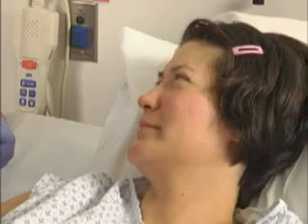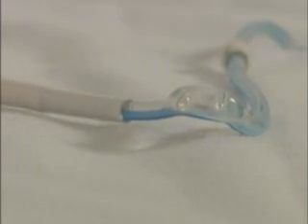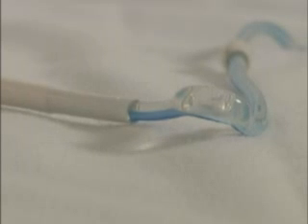This patient told me sometimes if I flush real firm, it can work. Do you want me to give that a try? No, you shouldn't do that. Using excessive force can cause this catheter to aneurysm or to rupture. You should only flush if it flushes with ease. Otherwise, it means we need to clear the catheter with some TPA.